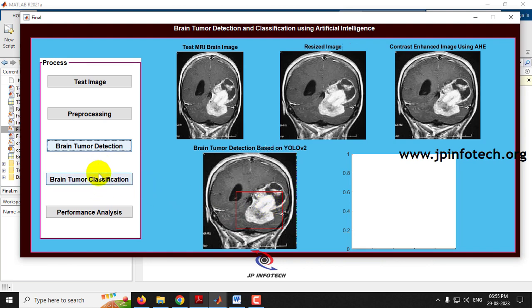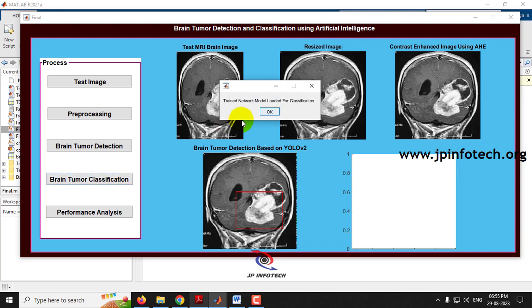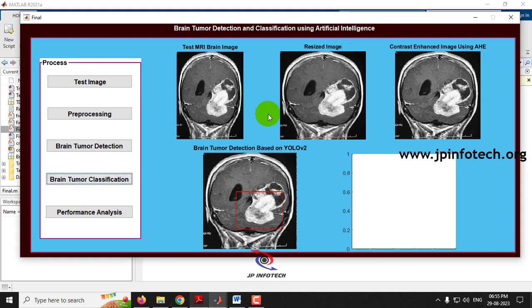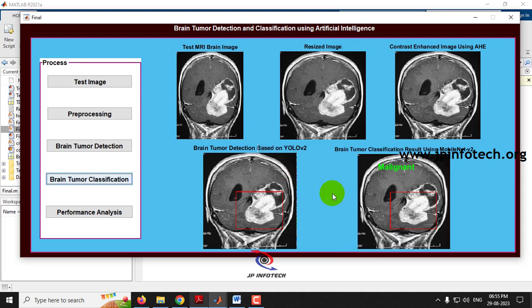Now it will classify the brain tumor into one of the two classes. Click 'Brain Tumor Classification' — the trained network model is loaded for the classification part. Click OK and you can see the brain tumor classification result using MobileNetV2: this image is classified as malignant, which is the cancerous type.